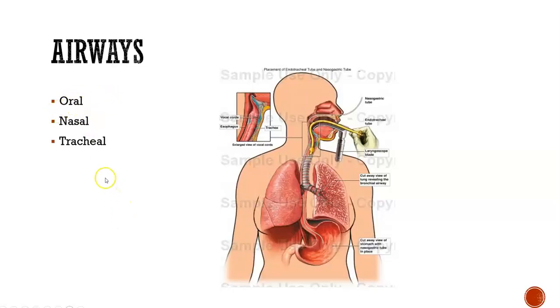And really the reason for that is because leaving an ET tube any longer than it needs to be, we start running the risk of things eroding, and it's just going to create a lot of issues, because that's not where it's supposed to be. It's technically a foreign object in the body. So we start looking at putting in tracheostomies and going from there.